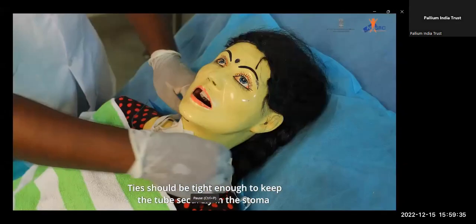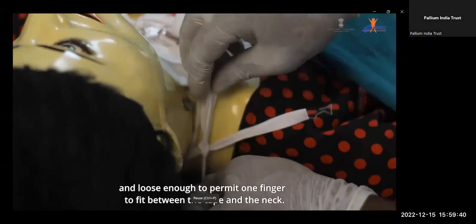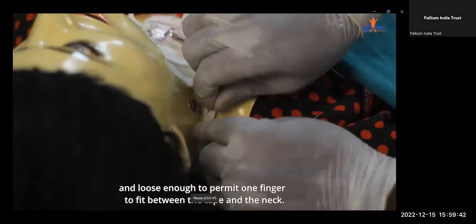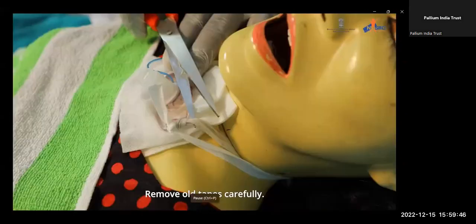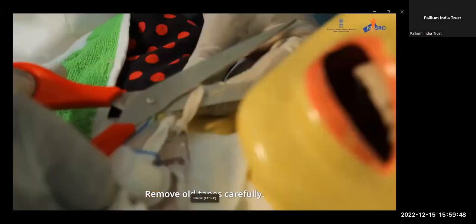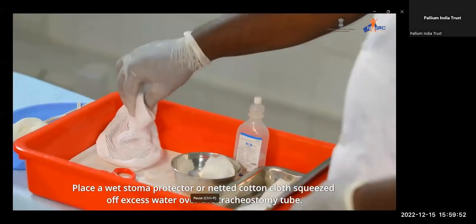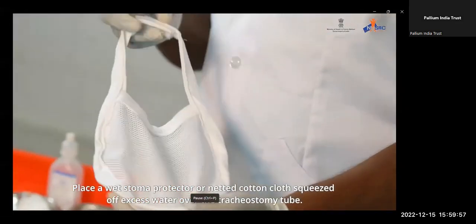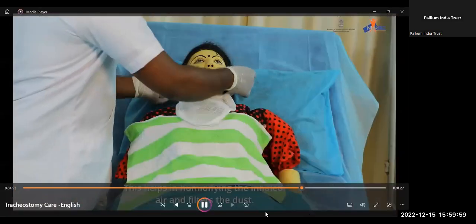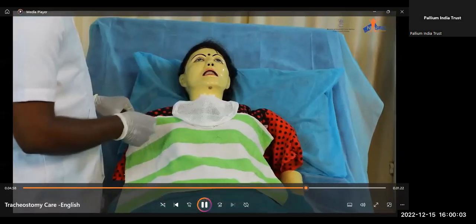Ties should be tight enough to keep the tube securely in the stoma and loose enough to permit one finger to fit between the tape and the neck. Remove old tapes carefully. Place a wet stoma protector or netted cotton cloth squeezed off excess water over the tracheostomy tube. This helps in humidifying the inhaled air and filters the dust.